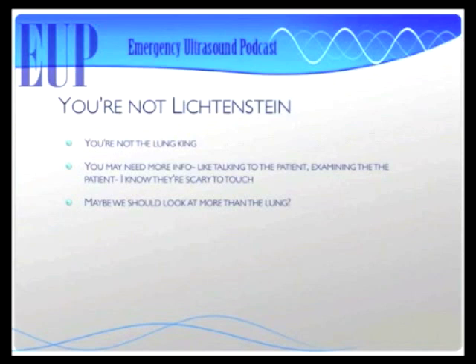So I guess the trick is that you're not necessarily Lichtenstein, so you might not be this good. So you might want to do some other things like maybe expand your ultrasound evaluation. You might want to actually look at the patient. You might want to touch the patient. Wait a second. You just told me that ultrasound was like 90% sensitive. What's the sensitivity of my physical exam? Oh, yours is probably 100, Dawson. So anyway, my point is you might not be quite this good, so you might want to put a little bit more effort into it. Okay, so you're saying combine my history and physical with ultrasound.